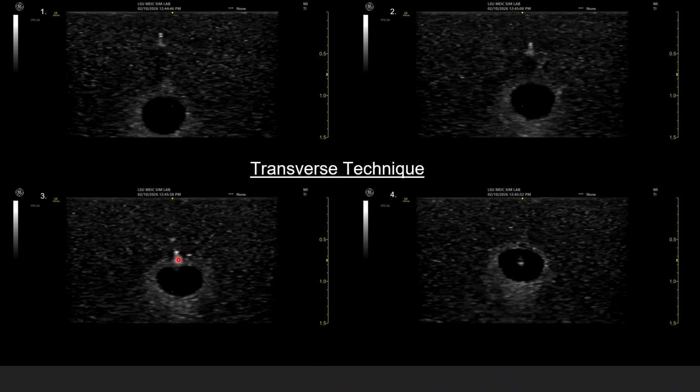So now the needle is making contact with the vessel. Then I'd advance my probe a little bit further along until I lose the needle, and then I'd push the needle forward, and now I've entered the vessel lumen. So now I can look for flash, or I can use another technique with inchworming where I keep pushing that needle into the vessel, keeping it centered, just like it's pictured there, until I'm comfortable with how much needle I have in the vascular structure. Then I can get my guide wire and slide it through my needle to progress along with the procedure.